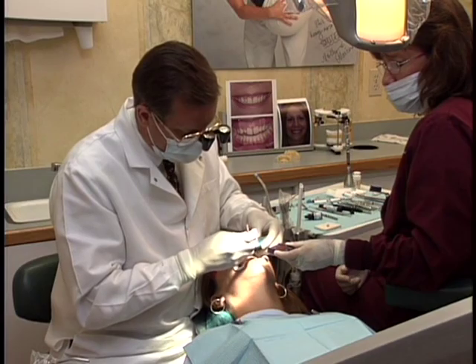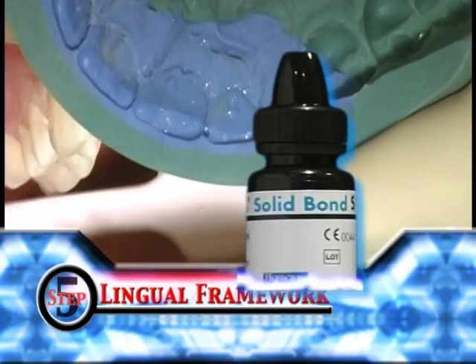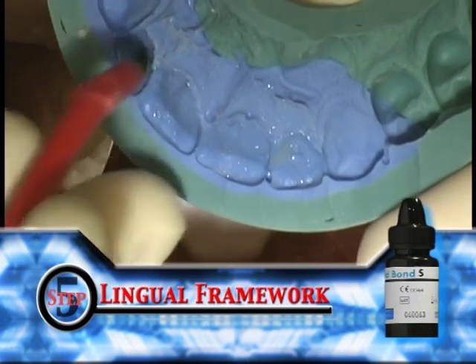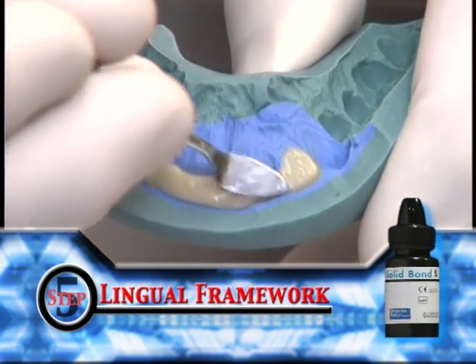Our next step will again involve the silicone index. Apply a special lubricating agent such as Gluma Solid Bond S to the silicone index. Gluma Solid Bond S is a lightly filled bis-GMA resin designed specifically for this purpose. The index is used to help shape the composite.